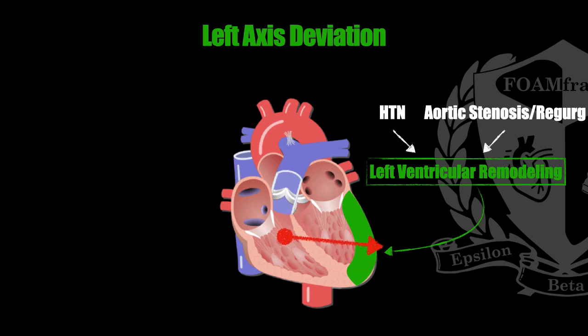Some other conditions to consider if there's an acute leftward axis: some valvular disorders tend to cause the same leftward axis as well. If there's aortic stenosis, where the aortic valve is not opening enough, then blood will remain stagnant and pool within the left ventricle, as well as mitral regurgitation or aortic regurgitation. If blood's not being emptied properly and is still pooling within the left ventricle, then the compensatory mechanism is to generate a more forceful contraction by remodeling and hypertrophying.